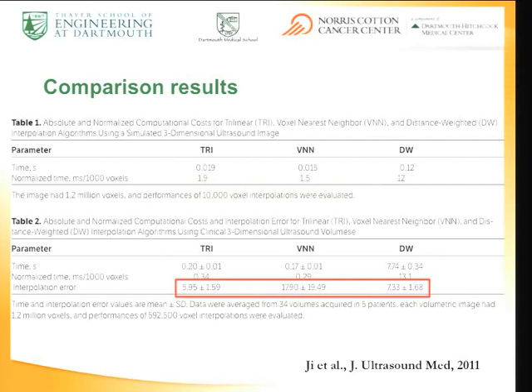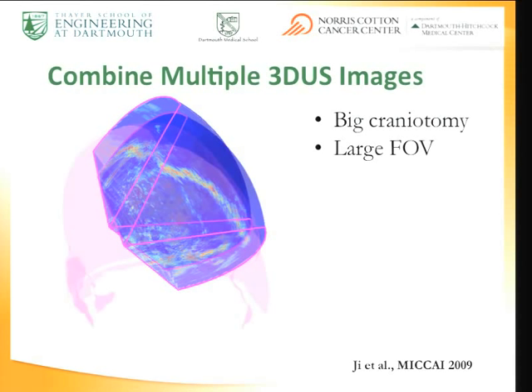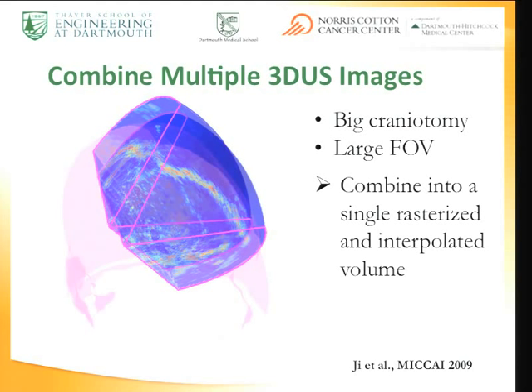So this we started to adopt. The other nice thing about it was that it allowed us to combine multiple acquisitions. While you put the scan head down, David would make an acquisition. If he decided to move it, we could take another acquisition, and take a few acquisitions so you could really get a detailed sampling. You could also average those samples. Having this ability to project the information into this Cartesian grid allowed us to do that very efficiently, combining into a single rasterized interpolated volume.